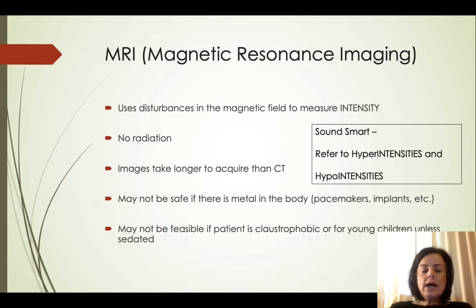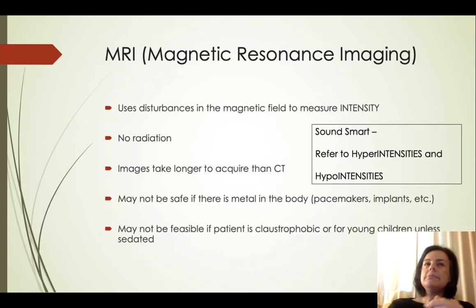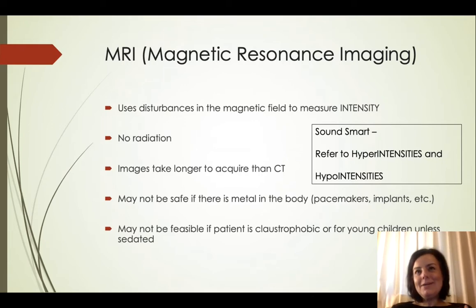Okay, MRI. So CT. Let's think about CT one more time. CT uses radiation. It assesses density, so hypodensity and hyperdensity are the kinds of things we talk about. I didn't mention this before too much, but you can give contrast with CTs, and it's iodinated contrast.